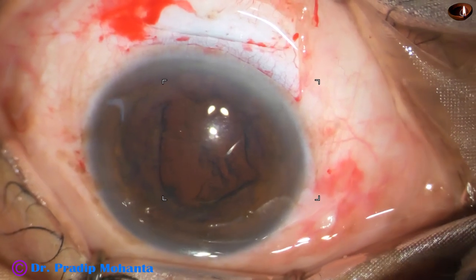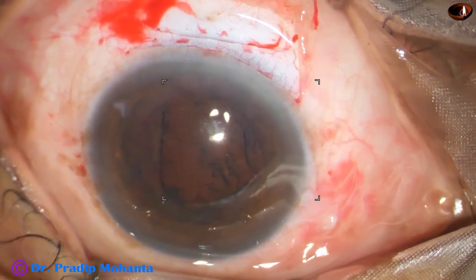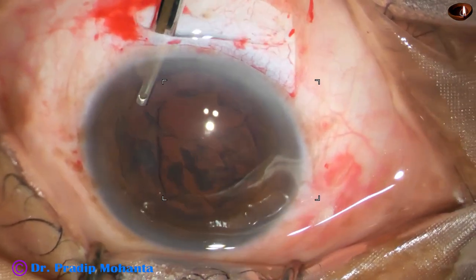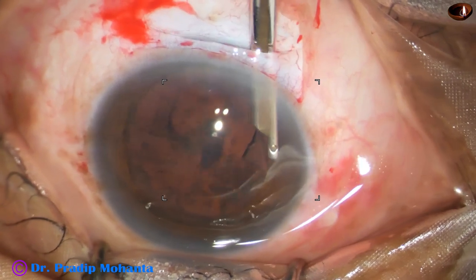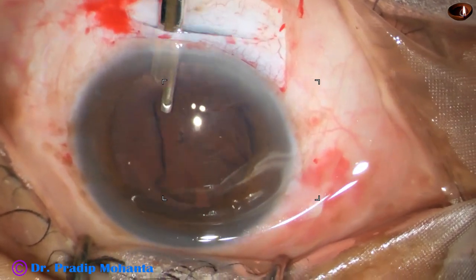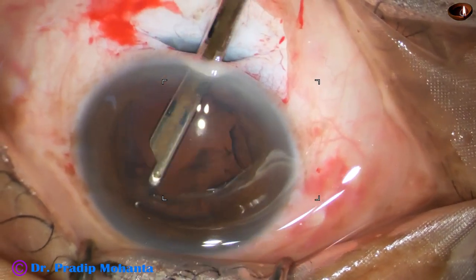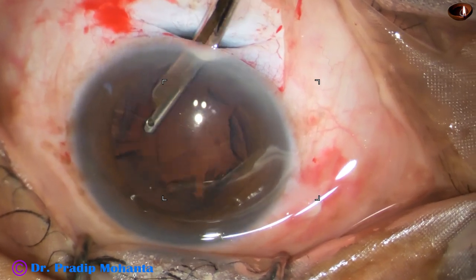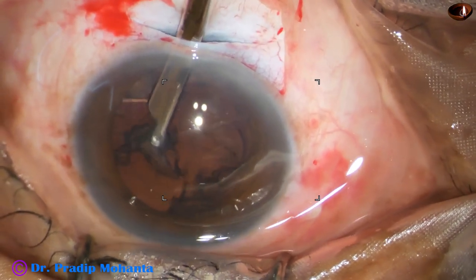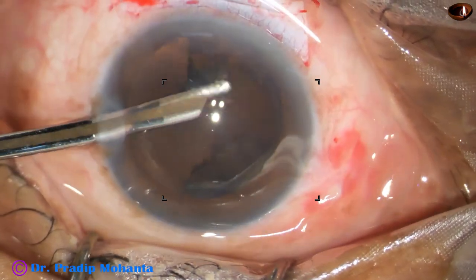Cortical cleanup is to be done. Before starting aspiration, a gentle stream of BSS or Ringer's lactate is directed towards the cornea so that whatever cortex sticks to the back of the cornea gets displaced and we get a clearer view. Through the main wound the sub-incisional cortex is removed, and then through the side port the rest of the cortex is removed.